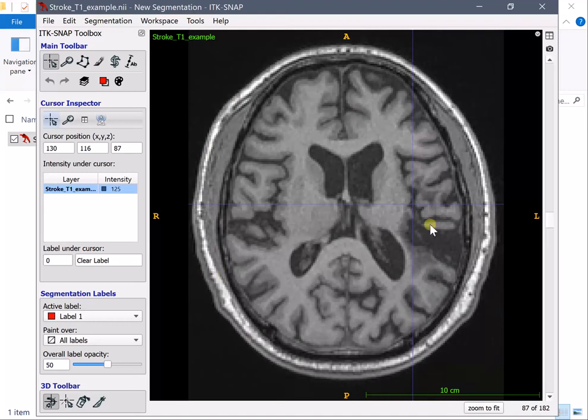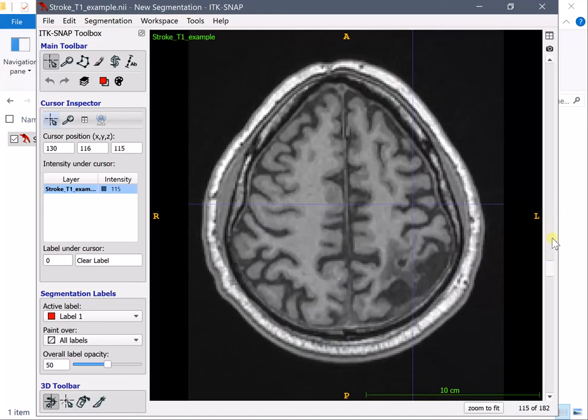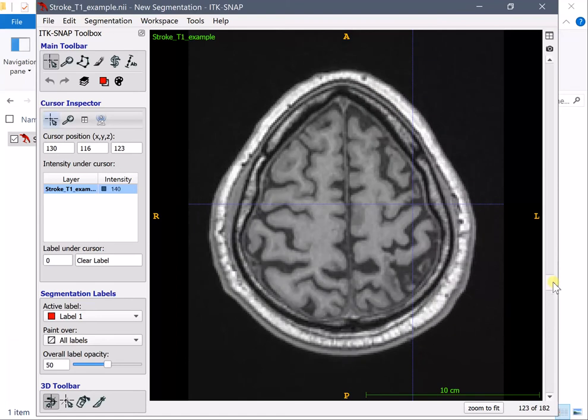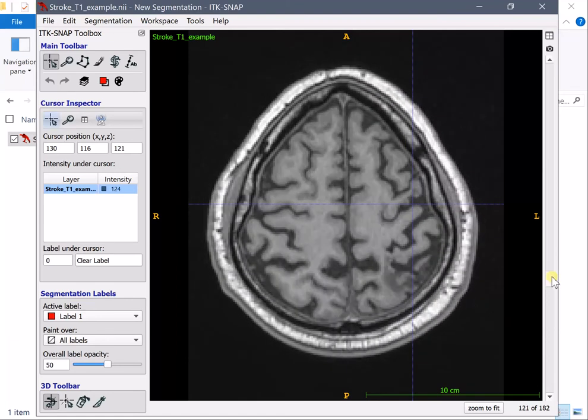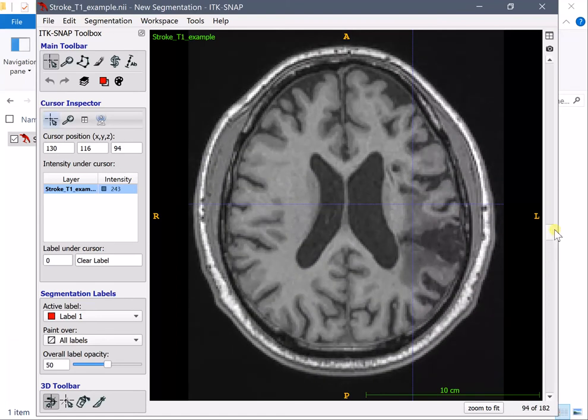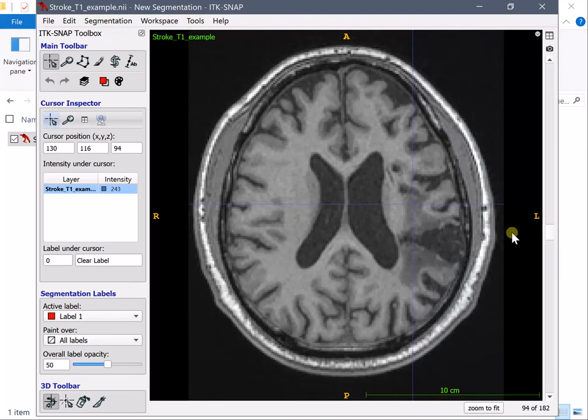Now we can go back and forth with this slider on the side and let's start, you can start somewhere even where you are sure that there is a lesion and you can start to draw. How do you draw?